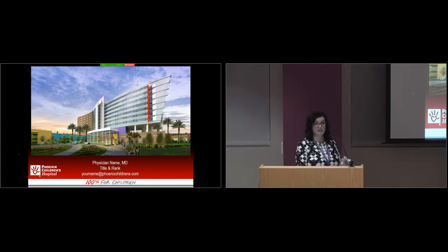In little ones, when the hip is flexed, the catheter can migrate higher. So typically when we're placing the line, we'll flex the hip to see the highest point of the catheter to get it at the diaphragm. So as long as it has a nice vertical course, the risk of complications, just like for SVC, should be lower.